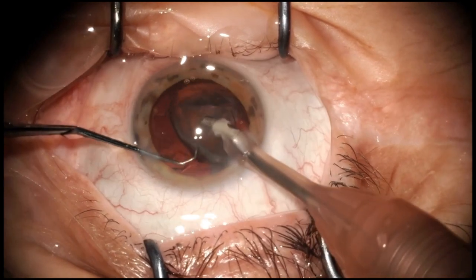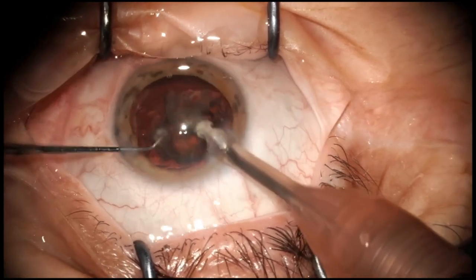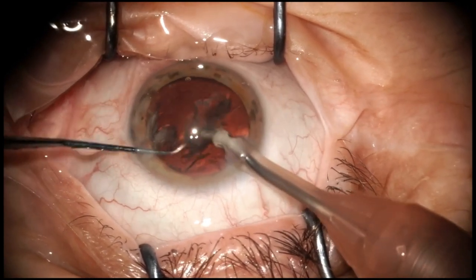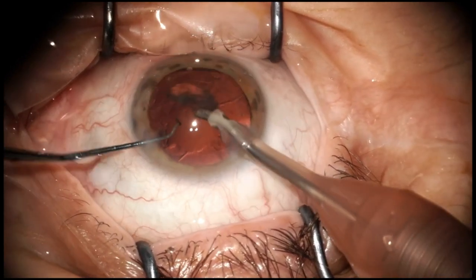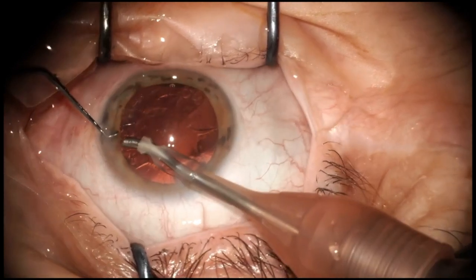I like low fluidics settings because the total amount of fluid which passes through the eye is less, and on the next day the cornea is clear. Now this is the end of the emulsification.